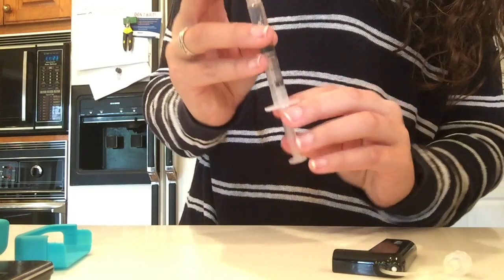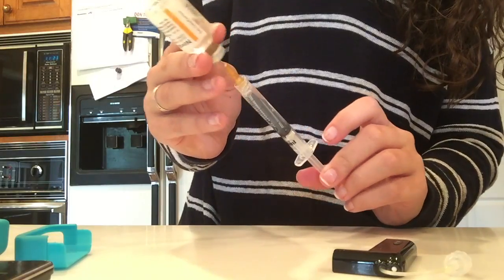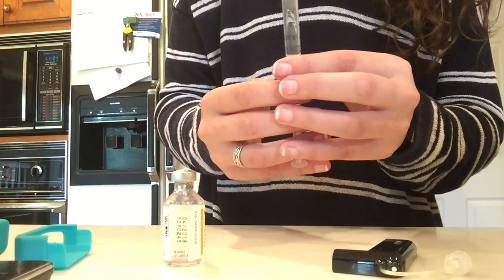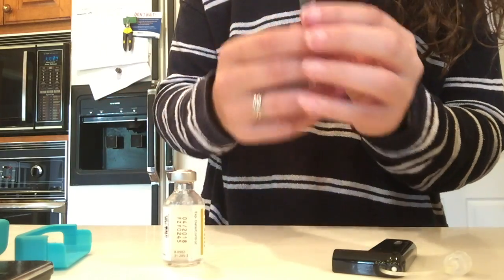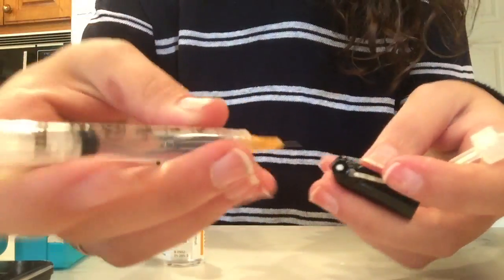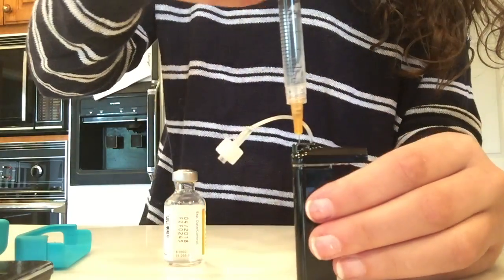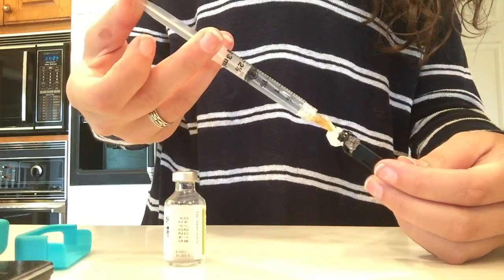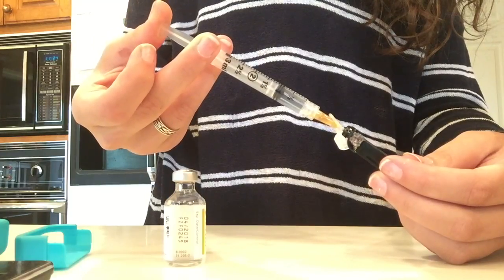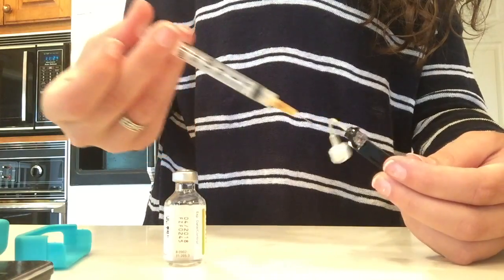I'm just flicking it to get all of the bubbles out — the bubbles were very prominent today. Then I'm just filling up my cartridge. You're going to flick any more bubbles out and push any air bubbles out that you can. Then on the cartridge for the T-Slim there's a little white dot right there — you just stick the syringe in the little white dot and it should go about halfway in. Then you just push the syringe so the insulin comes out, and that's how you fill your cartridge. The little white dot on the cartridge is a lot like the top of an insulin vial — you just push in on that and push your insulin in like that.